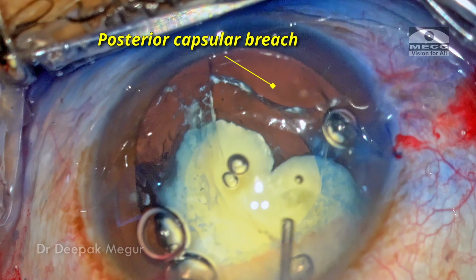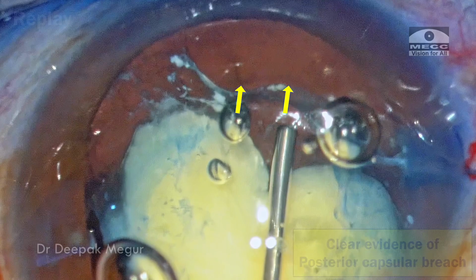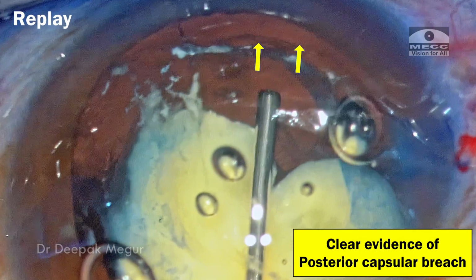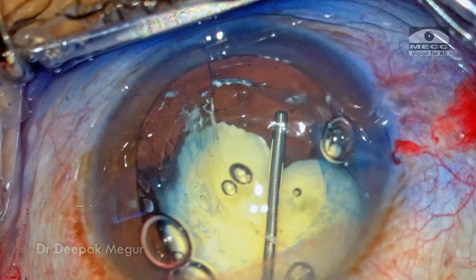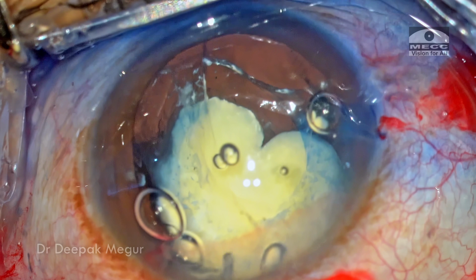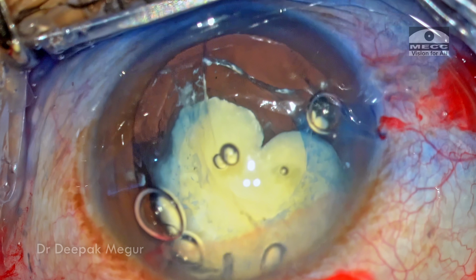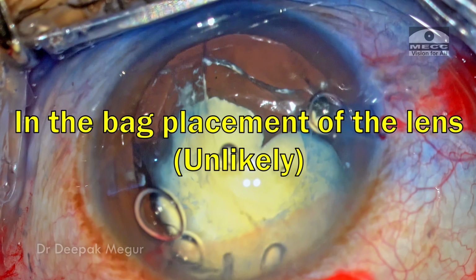And the crescent area which I was telling about initially, that's the area where the breach is, and you can see the OVD has gone out of the bag and it's in the clear space. So clearly when the bag is breached, the option of using the CTR is out now. The in-the-bag placement of the lens also seems very unlikely because I can't stabilize the bag.